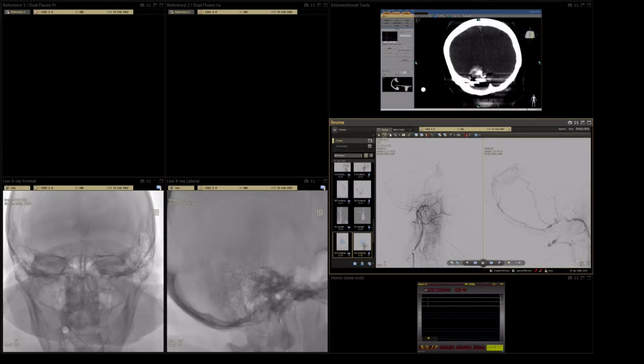We had some a leak from the Y connector because of the click Y connectors. It's okay.